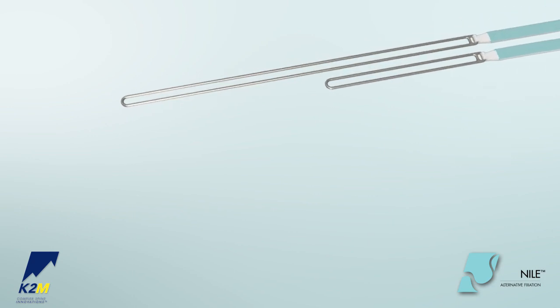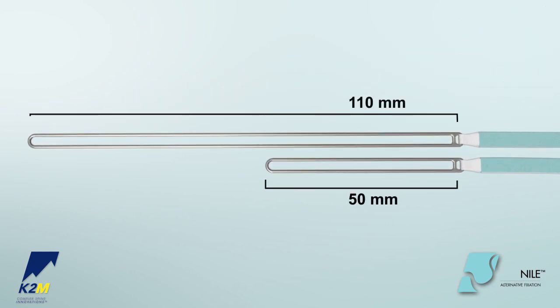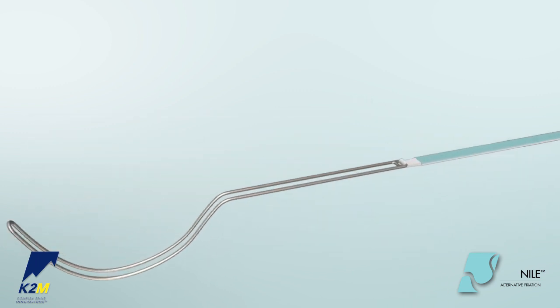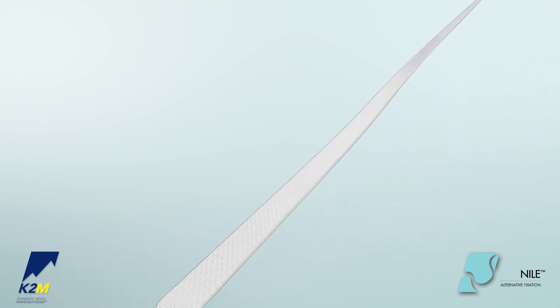The Nile Alternative Fixation Band has a 50 mm length leader on one side and a 110 mm length leader on the other side. Shape one side of the leader into a C shape. The Nile Alternative Fixation Bands are color-coded to indicate orientation.